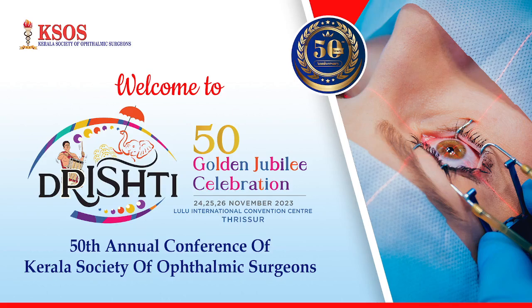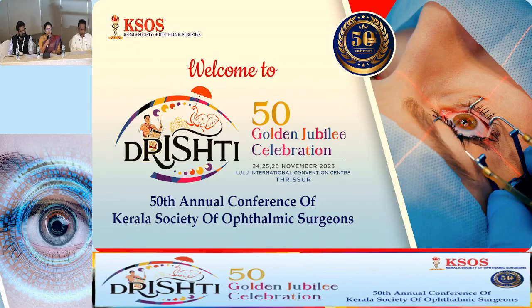It mainly deals with various intraoperative complications during phacoemulsification. So first talk is on confronting wound-related issues by Dr. Meenu Mathan. Over to you, sir.